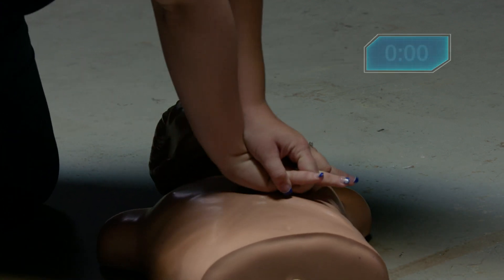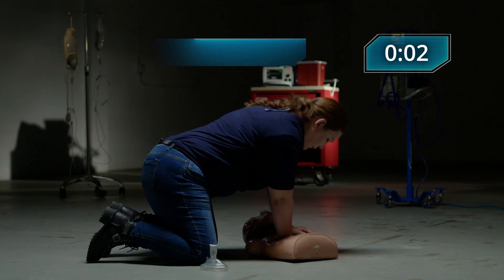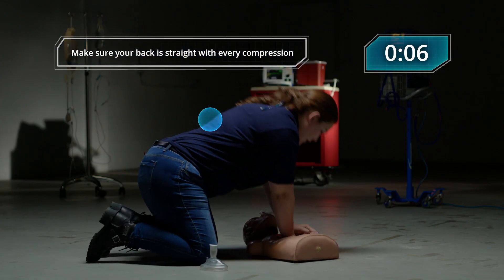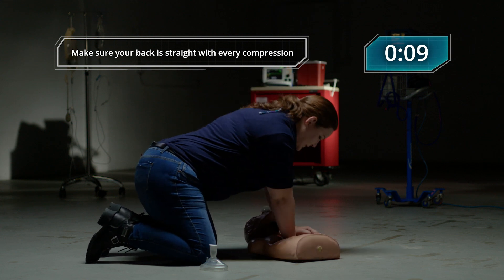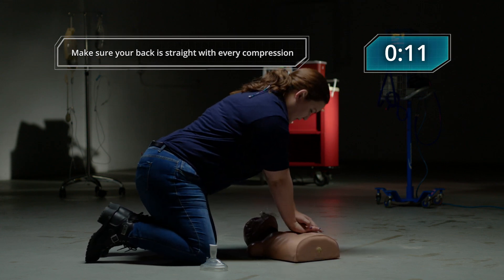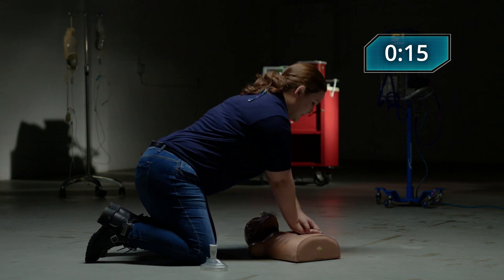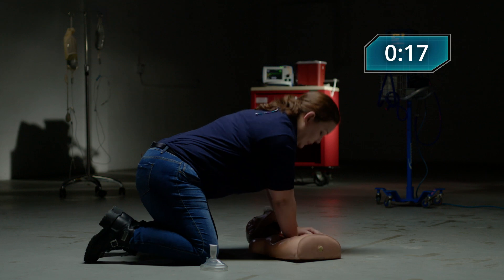Compressions beginning. One, two, three, four, five, six, seven, eight, nine, ten, 11, 12, 13, 14, 15, 16, 17, 18, 19, 20, one, two, three, four, five, six, seven, eight, nine, 30.